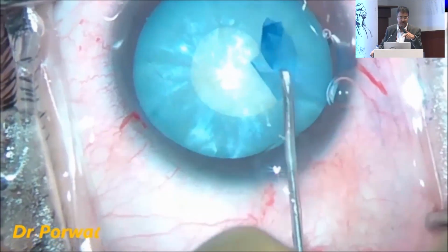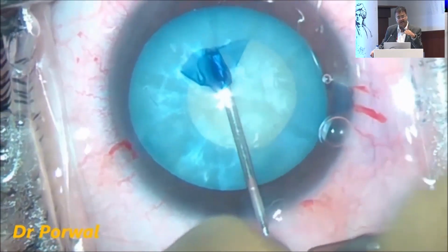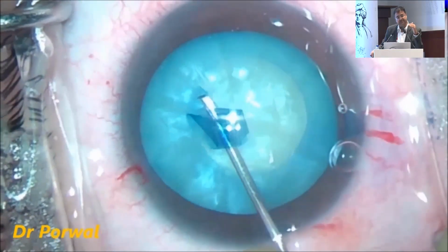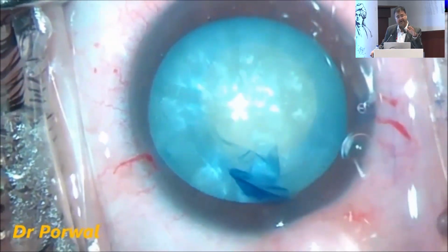Now I'm doing this in a snail pattern. First I started with a small rhexis, then I thought I have better control, so I can do a snail pattern rhexis. So you have to decide on table which technique you are going to adopt. Always make sure that the flap is flat. Even if you have a decentered rhexis in this type of cataract, don't bother.